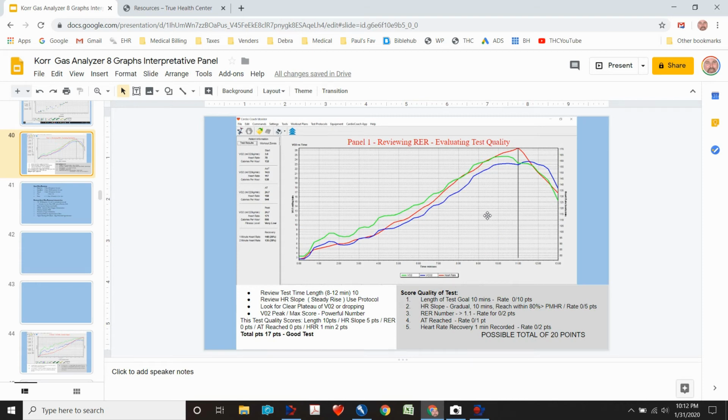And so that's pretty straightforward. I just wanted you to be aware of it, that we want to get that data, and it'll fit into a much larger interpretation or a more systemic overview of interpretation. And that's all I got to say on that.